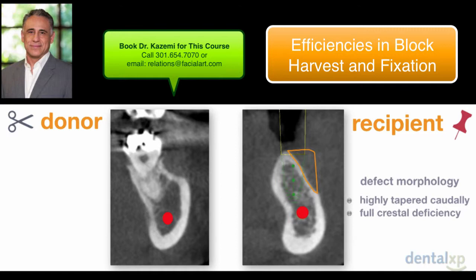And in this particular patient, being the fact that we have a fairly tapered defect, our intention is going to have to be to angulate our sagittal osteotomy angle sufficiently that we obtain a highly tapered block form. Hence, we have a very thin inferior border while we're maintaining a full width at the crest.